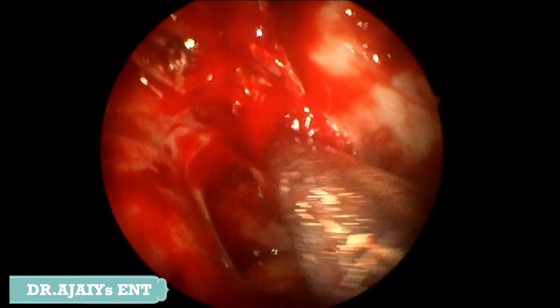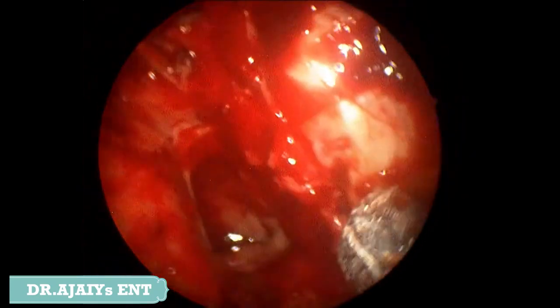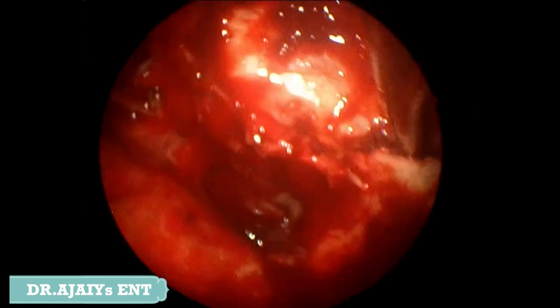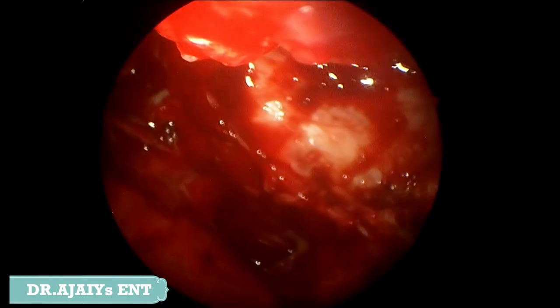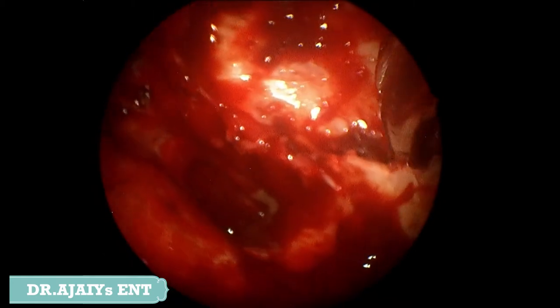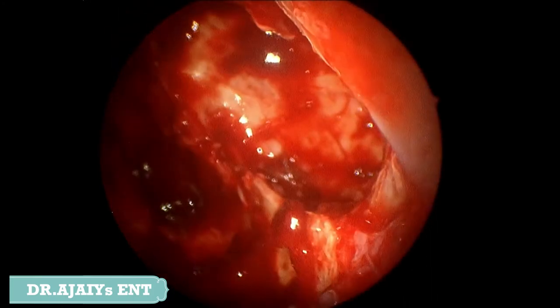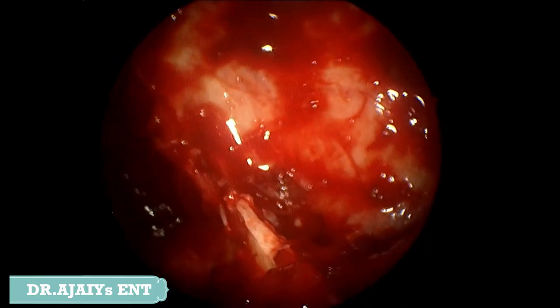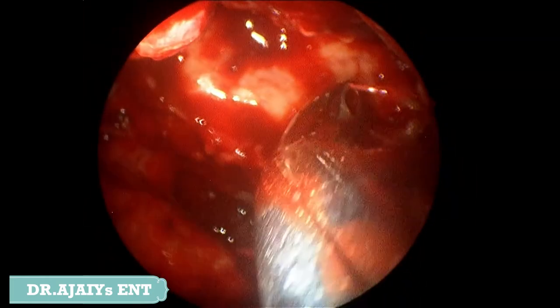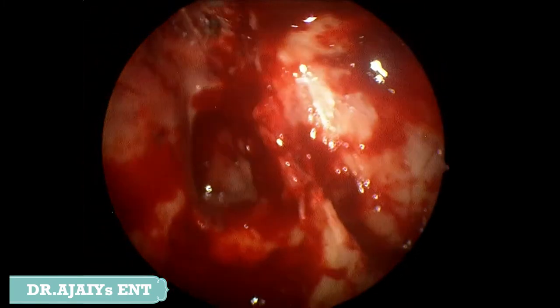This is the final picture. We are still removing a few necrotic contents from the floor. We could see whitish contents along the floor of the maxilla that we wanted to remove. Even leaving out a small amount of contents from the floor along the palate area is going to create an issue again. We can start antifungals, but if possible, we need to make complete clearance of all necrotic contents.